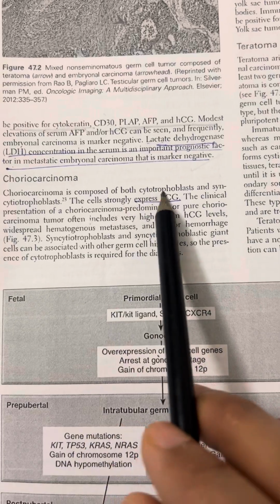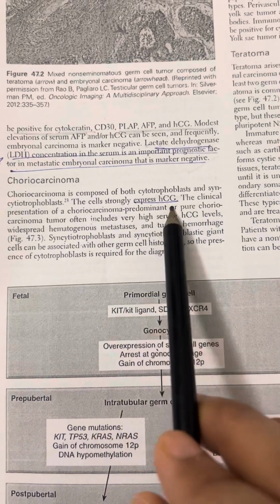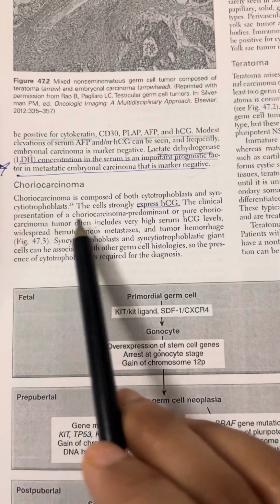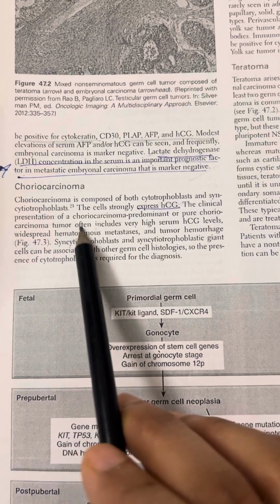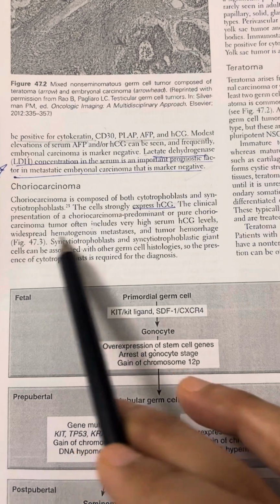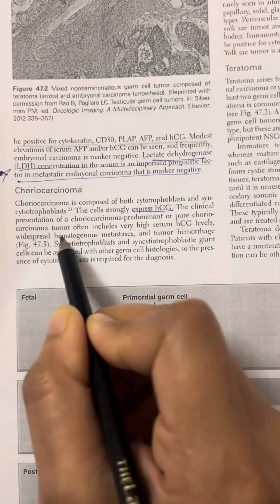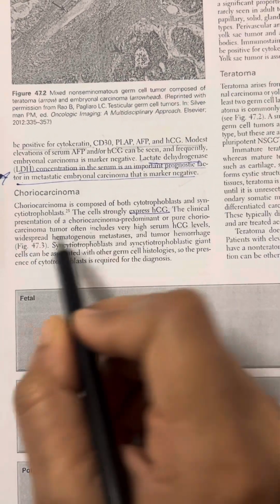Now second is choriocarcinoma. Choriocarcinoma is composed of both cytotrophoblast and syncytiotrophoblast. Cells strongly express HCG. The clinical presentation of predominant or pure choriocarcinoma often includes very high serum HCG levels, widespread hematogenous mets, and tumor hemorrhage.